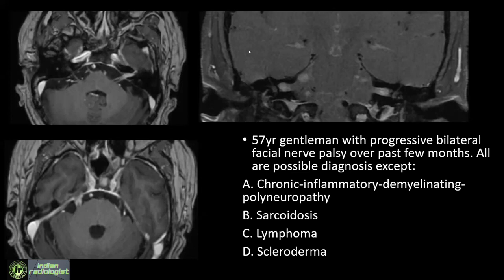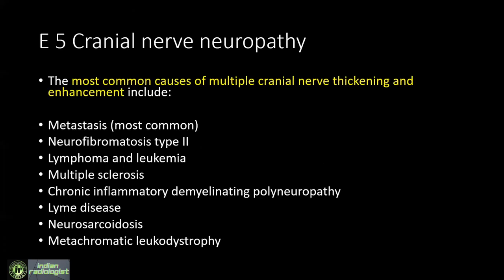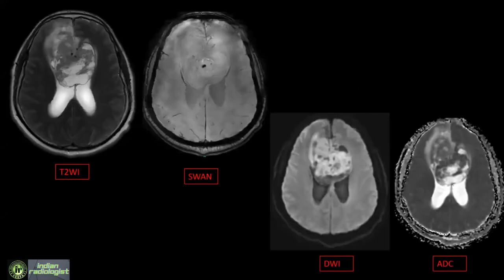What we are seeing on this image is multiple cranial nerves that are thickened and enhancing. The differential for multiple cranial nerve involvement with thickening and enhancement includes metastasis, neurofibromatosis type 2, lymphoma, leukemia, multiple sclerosis, CIDP, Lyme disease, neurosarcoid, and metachromatic leukodystrophy. Commonly seen are lymphoma, neurosarcoid, and metastasis, including paraneoplastic syndromes. Scleroderma will not cause CNS symptoms.